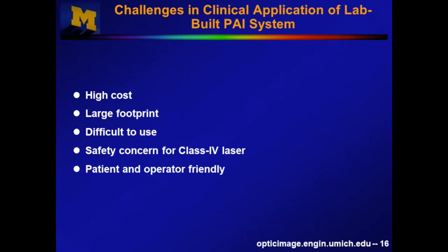So we have already pushed this technology and this application in rheumatology clinic for several years. And as I mentioned, we collaborate closely with the rheumatology division, rheumatology clinic at the University of Michigan. The rheumatologists, after collaborating with us for many years, told us some challenges when using the photoacoustic imaging to scan the human joints to diagnose the inflammatory arthritis.